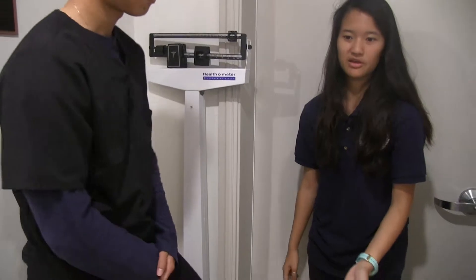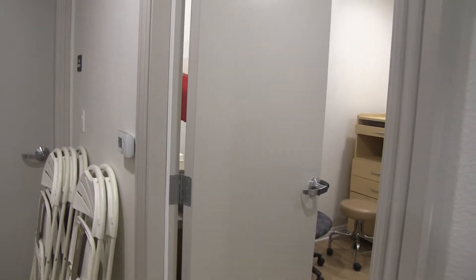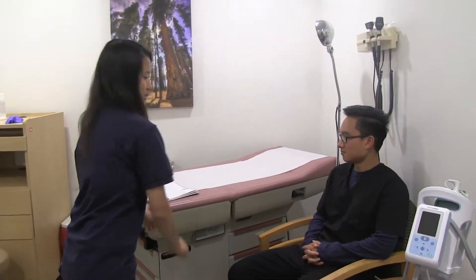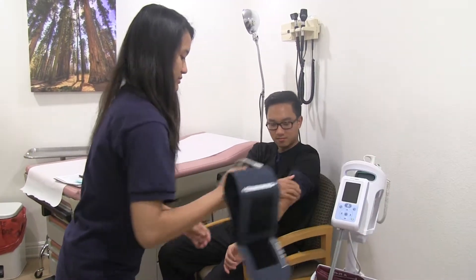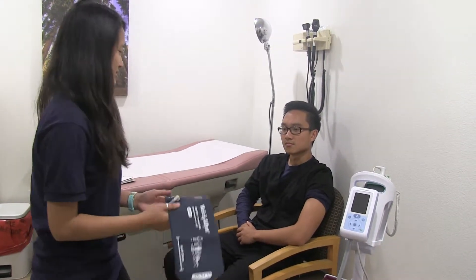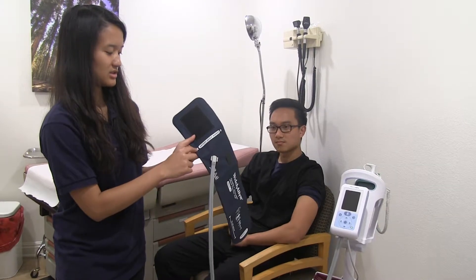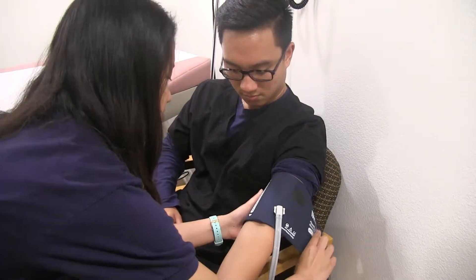Afterwards, you reset the scale and then let the patient know you'll be taking their blood pressure. Since he's wearing long sleeves, you ask him to roll up his sleeve. If it's impossible to roll up and the sleeve is constricting blood flow, you can take blood pressure over his shirt, but only if it's a thin shirt — if it's really thick, you'll need to ask him to change. For the blood pressure cuff, there's an artery line. You take the arrow and line it up with the brachial artery.